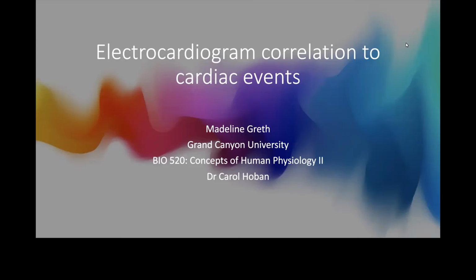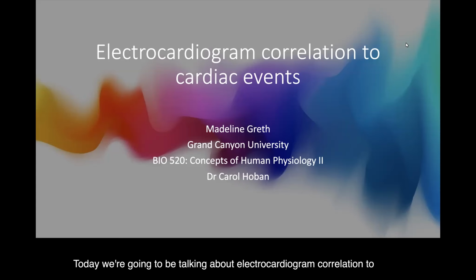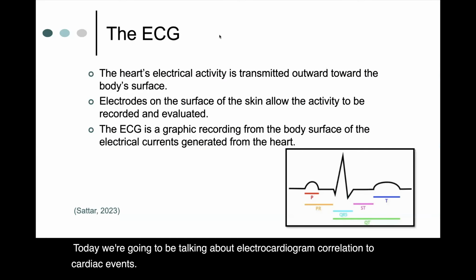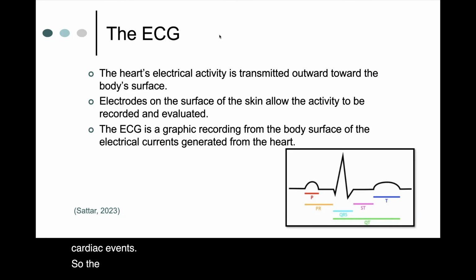Today we're going to be talking about electrocardiogram correlation to cardiac events. So the electrocardiogram, we're going to start there with that and what exactly that is.